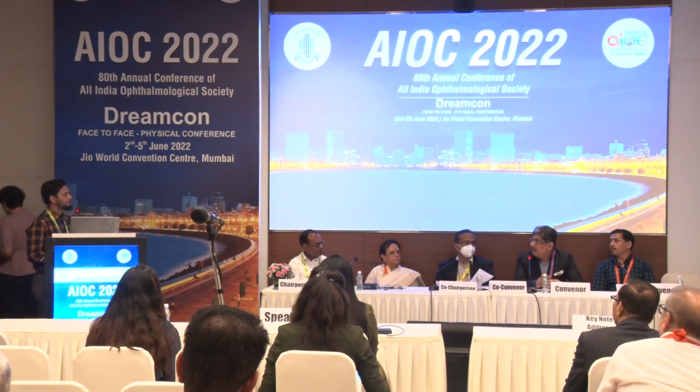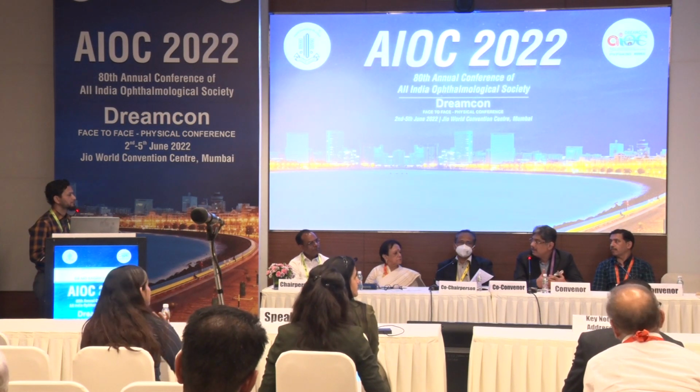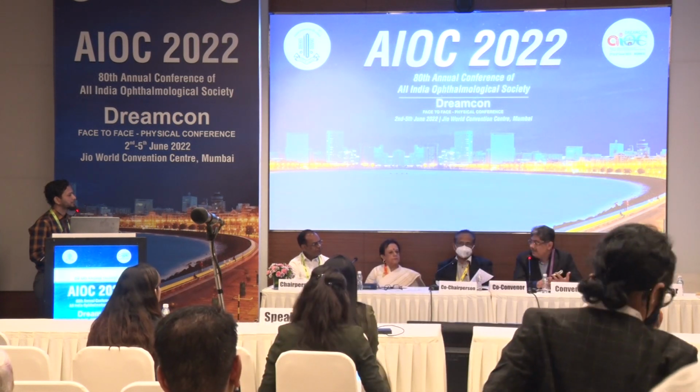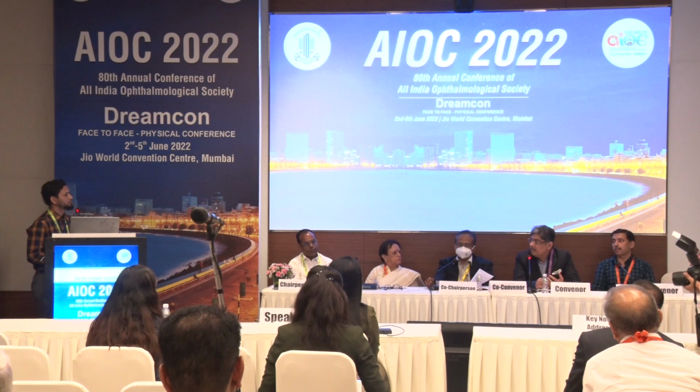But ultimately, what matters is that the latest generation formulas have come just because they take into consideration effective lens position. All these things matter to the effective lens position, and then we have an accurate IOL power calculation. But anyway, your efforts were good. Thank you.